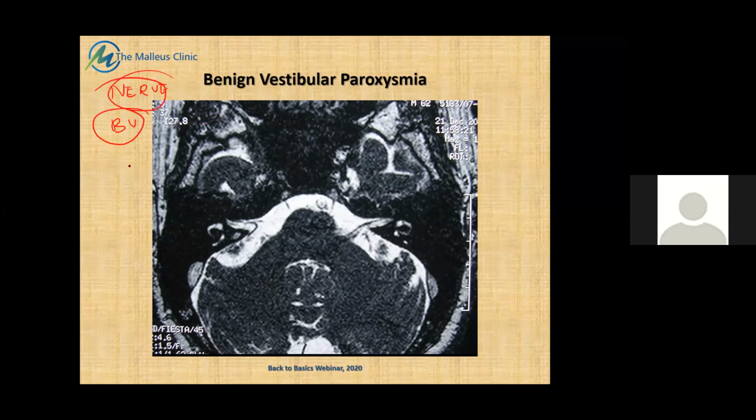So the usual protocols that are available are either a 3D CISS or a 3D FIESTA. Friends, I am a routine otologist. I'm not a radiologist. So if you ask me about the physics behind all this, I'll not be able to explain it to you. But yes, do collaborate with your radiologist. Do talk to them. Do tell them what it is that you wish to look for, and the radiologist would decide what's the best protocol to determine whether the patient is having a neurovascular cross compression or not.